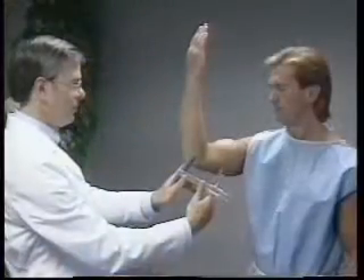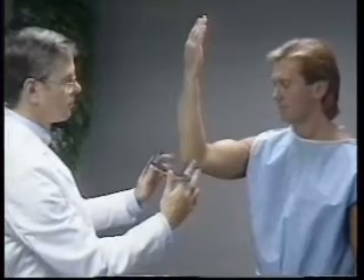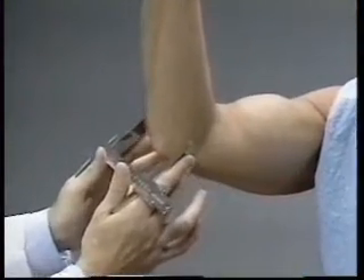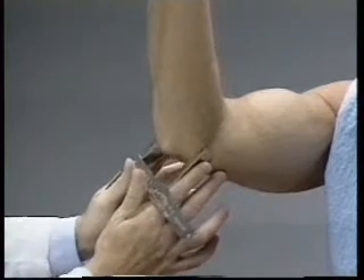While holding the caliper between the thumb and index finger of each hand, the technician palpates the epicondyles of the elbow with the middle fingers. The blades of the caliper are applied to the epicondyles at a 45-degree angle to the plane of the long axis of the upper arm.